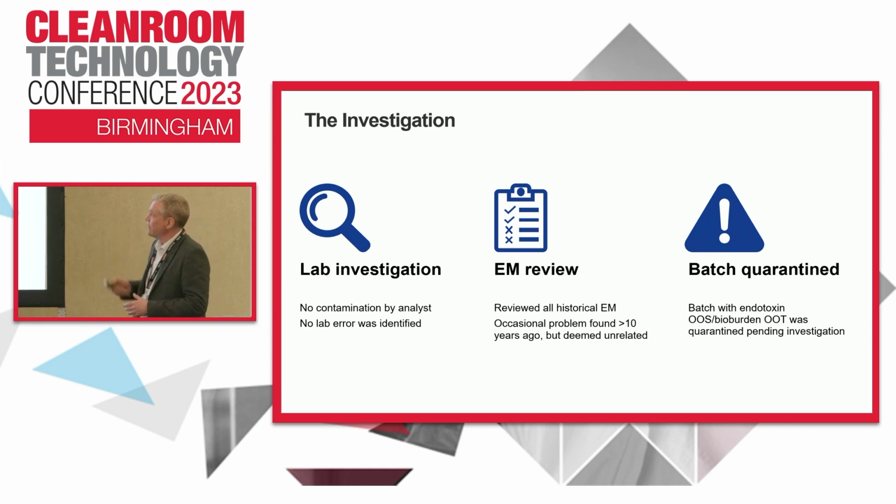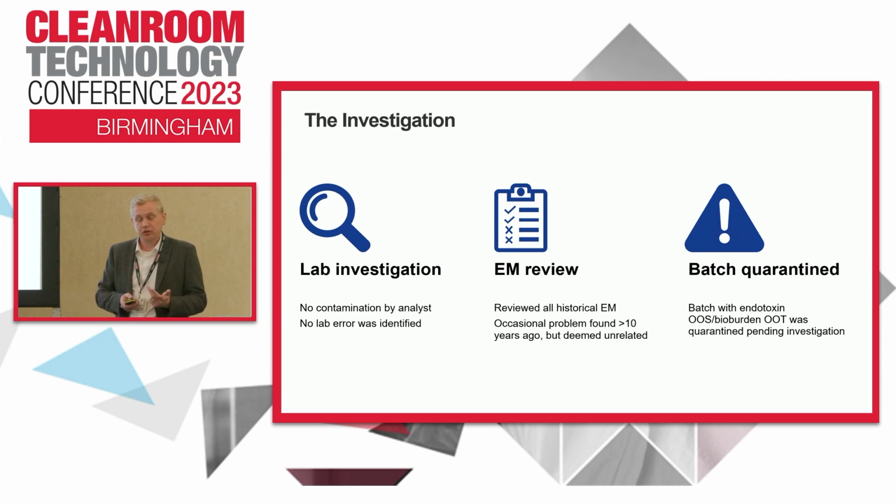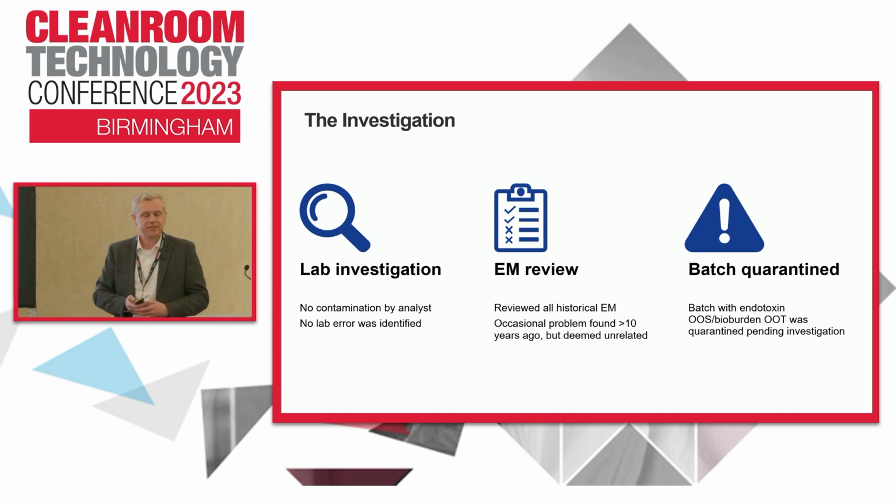Just going through the investigation, there was a lab investigation, as you'd expect. During that investigation, they determined there was no contamination by the analyst and no lab error was detected at all. They also carried out a comprehensive environmental monitoring review, and they found nothing of significance that could help with their current investigation. They did find some occasional problems more than 10 years previous, but they were deemed to be unrelated because they were so long ago. The batch associated with the out-of-spec was quarantined, pending the results of the investigation.